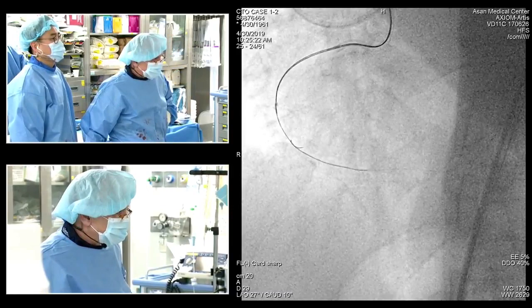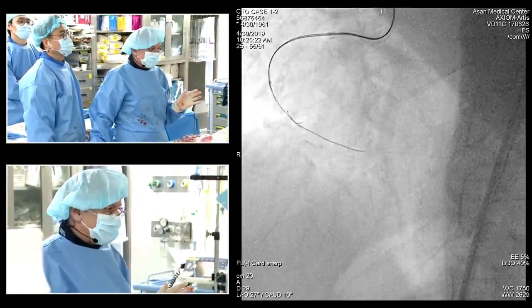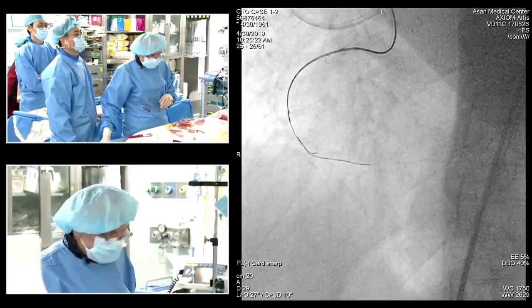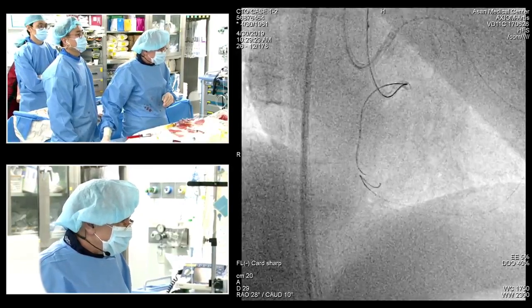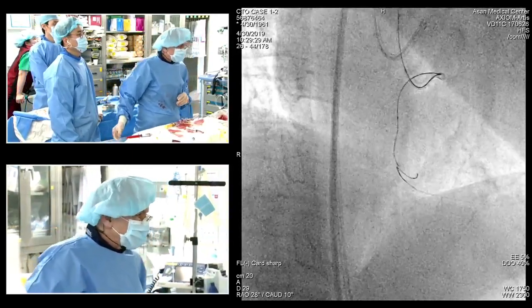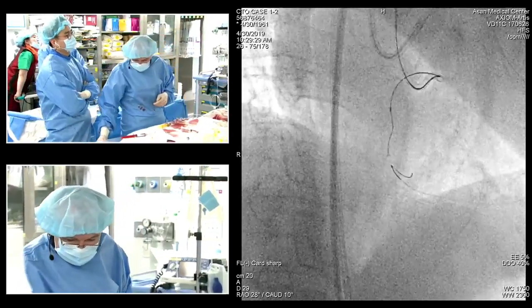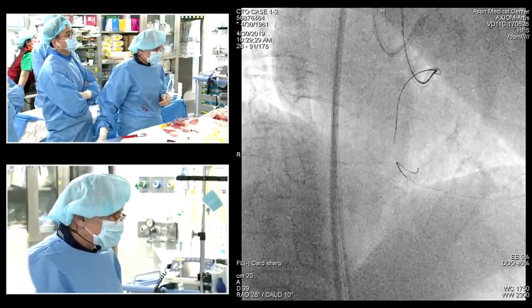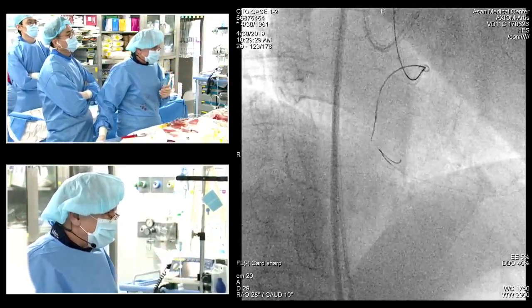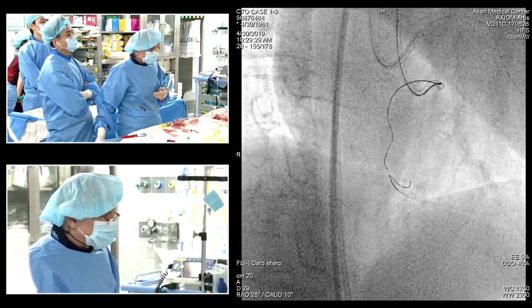And what we did was, I tried, of course, the Caravel a little bit, but I left it in position and then went with a Fine Cross instead of the Sasuke. Fine Cross went quite nicely. And then I worked with the Gaia 3. That is the ideal situation, I think, trying to get through. You see that we are dabbling around a little bit, but at one point, I got into the side branch.